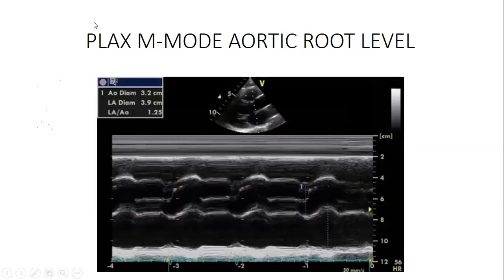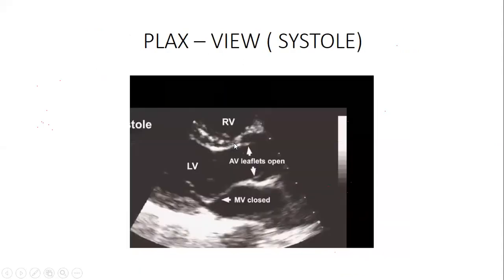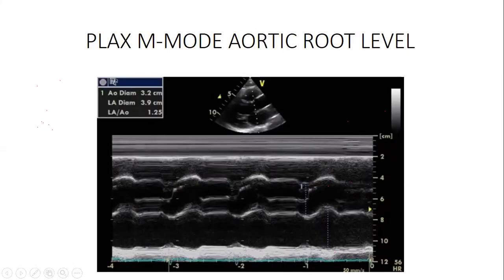Okay, parasternal long axis. I'll still show you the parasternal long axis, but using the M mode. Don't get confused. This is the same 2D. Remember, we had our 2D. This is a 2D, nothing color, nothing else. I've just applied the M mode. Now, with this M mode, if you look at where this scan line is passing, have in mind that this is a long parasternal axis.